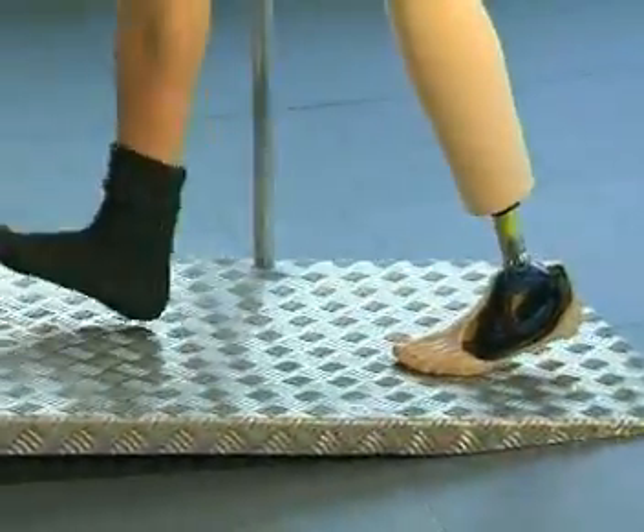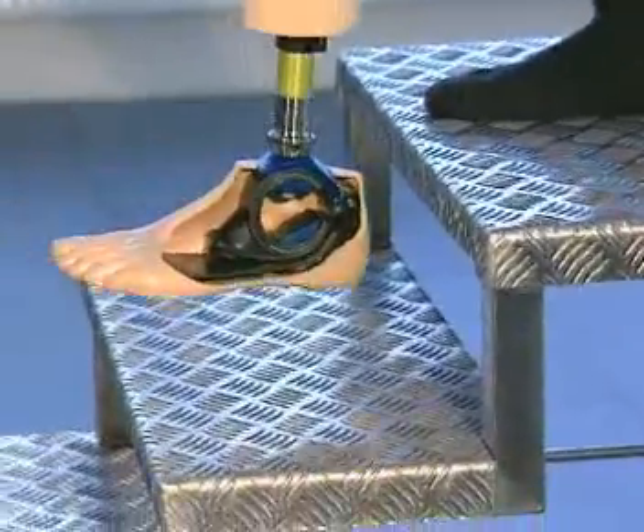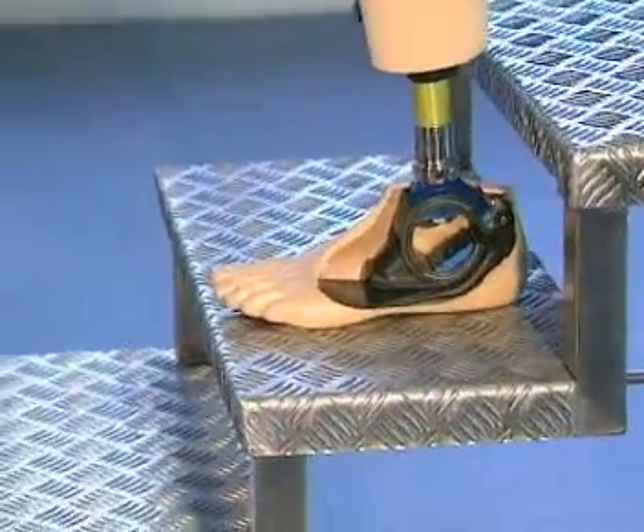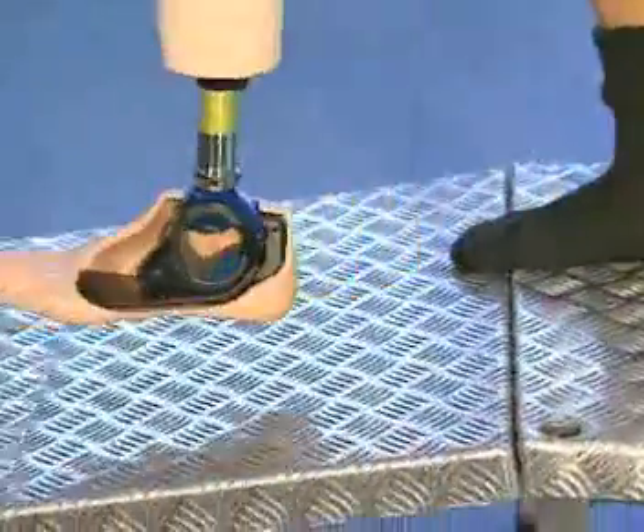The multi-axial motion of the Seawalk foot is particularly useful on gradients and inclines. The unique control ring ensures a smooth transition from one spring element to the other throughout stance phase.